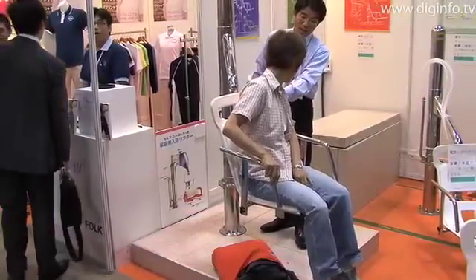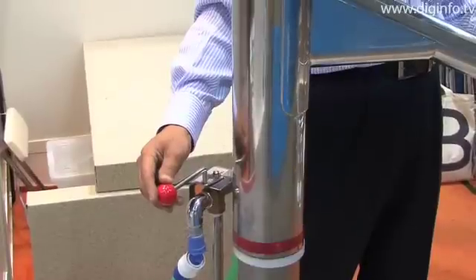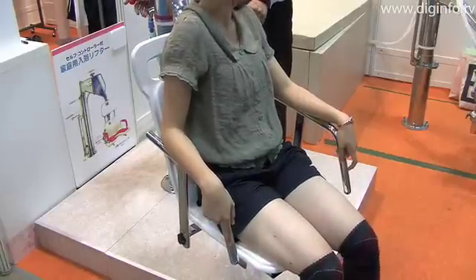The Universal Lifter from Universal Design is a nursing care bath chair that uses water pressure for lifting. With the Universal Lifter, the caretaker no longer has to personally lift physically handicapped patients in and out of the bath.